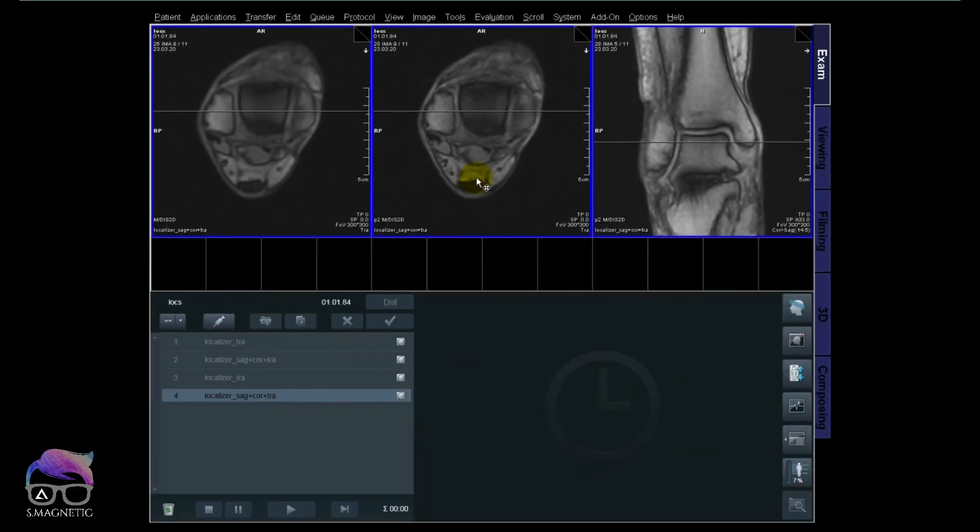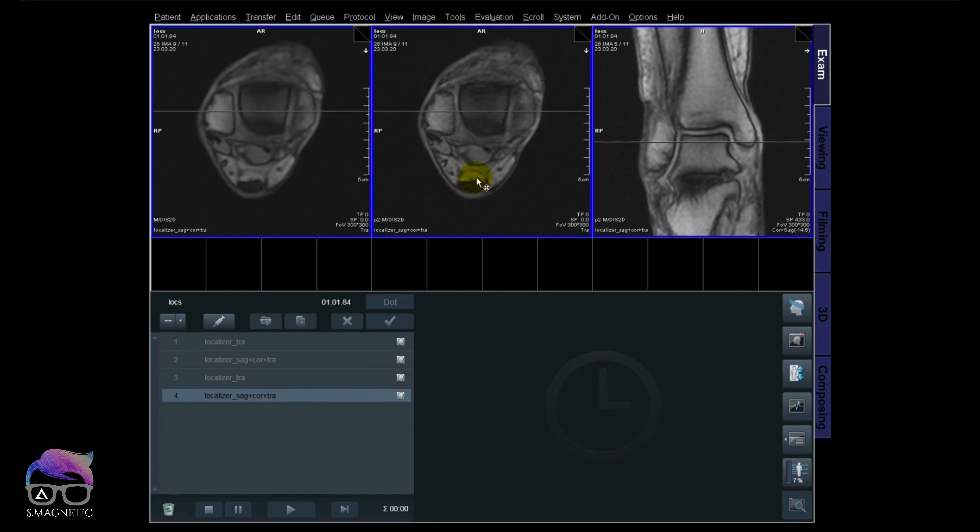So this just shows how easily you can improve your localizers in terms of having shorter scan time, speed things up, and even get better localizers. So also remember what coil you're using because you can really push it further with different coils. So just keep that in mind.